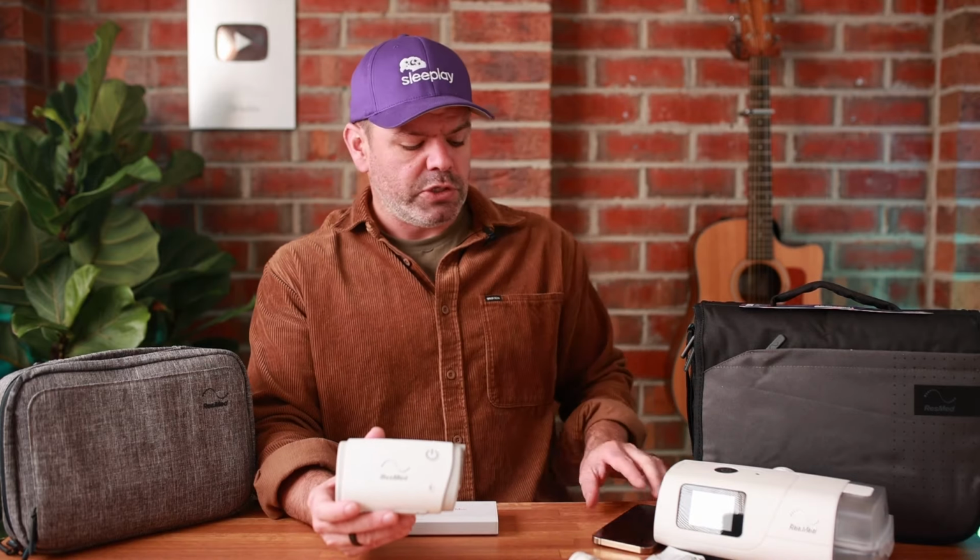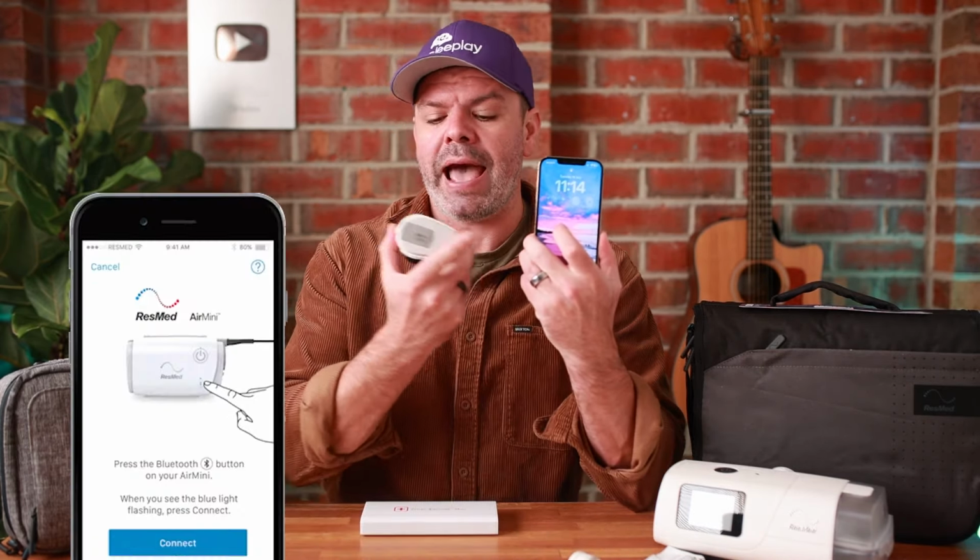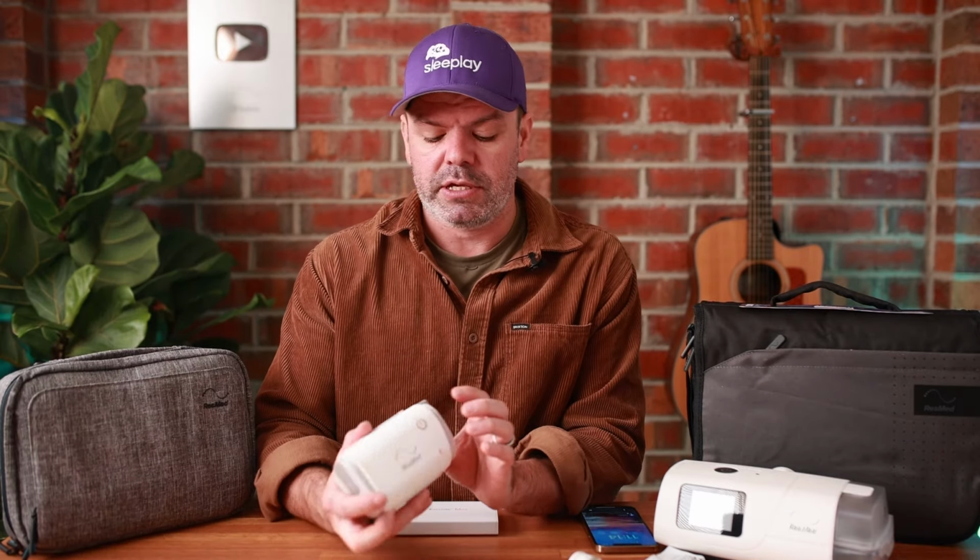Number 2, there's no screen. So in order to change settings, you need to pair it via Bluetooth to a smartphone and the AirMini app. So if you don't have a smartphone, then you're up shit creek without a paddle, unfortunately. There's only two buttons on this device. There is the on-off and the Bluetooth connect button. That's number two.